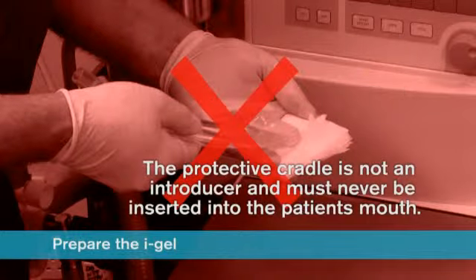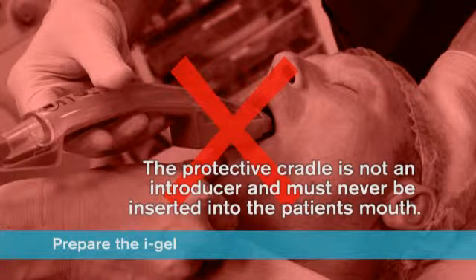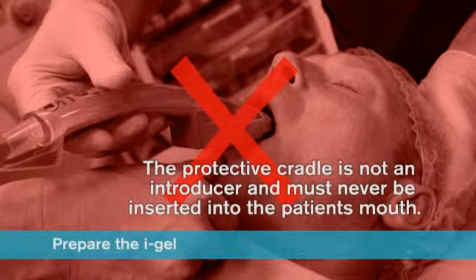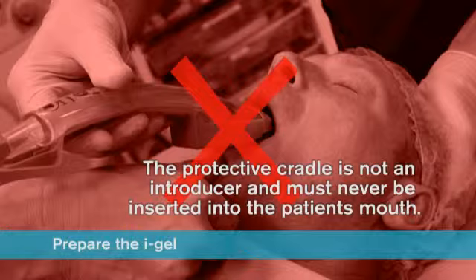The iGel must always be separated from the cradle prior to use. The protective cradle is not an introducer and must never be inserted into the patient's mouth.